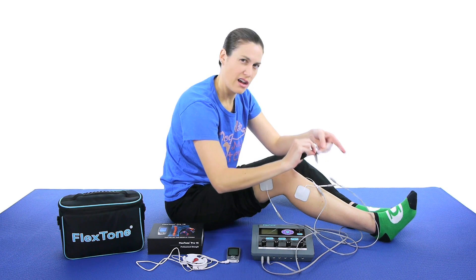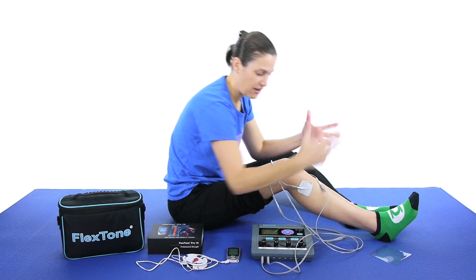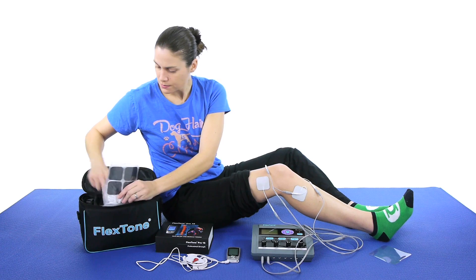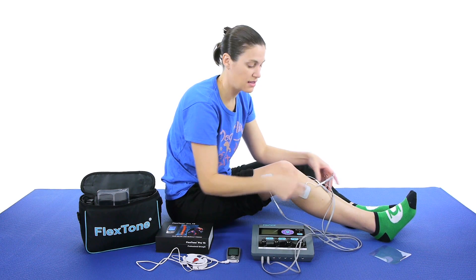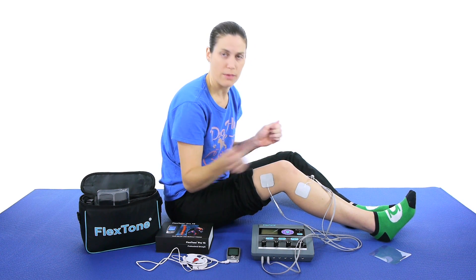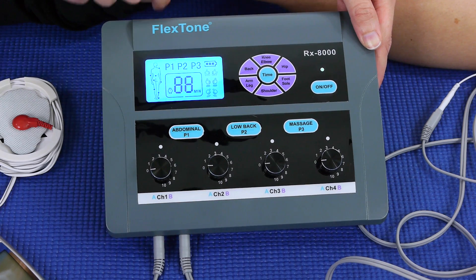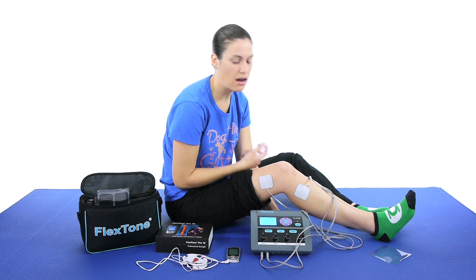It's best to not have lotion on your skin when you put these electrodes on. They are reusable — you have one set for you, and then there's a big pack that comes with a whole bunch of them in different sizes too. Once they wear out, usually after about 3 to 4 weeks, you just get a new set. But there are also some that you can put gel on — they're reusable and you put the gel on, then wipe it off and clean it, and use those again. So you turn the power on here, and it has a whole bunch of different settings — it's almost preset for you so you don't have to figure out the current levels.